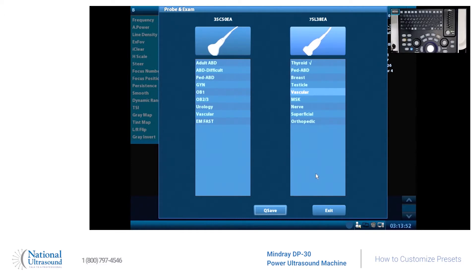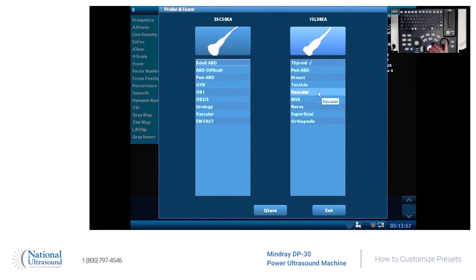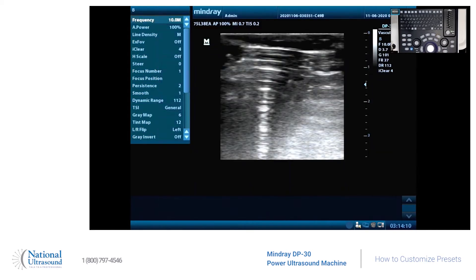First off, we're going to select the probe — this is the probe screen. So there are only vascular settings; it doesn't distinguish vascular from carotid to lower extremities. I want to make a carotid setting, so I'll select the default vascular setting and scan my carotid to get a visualization of what we like best.